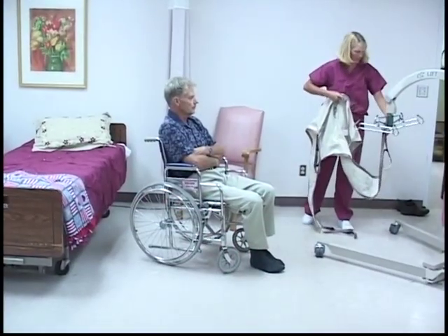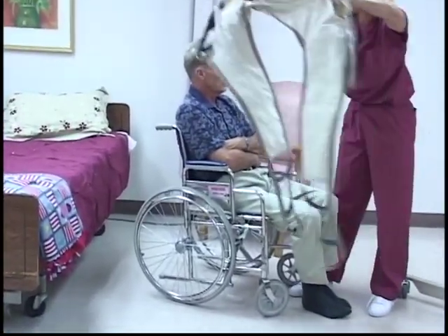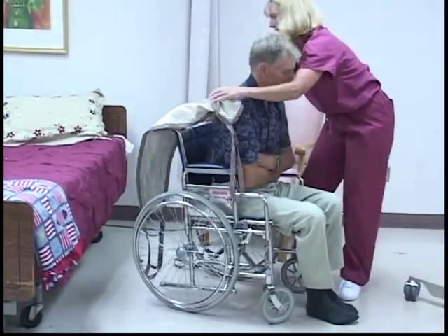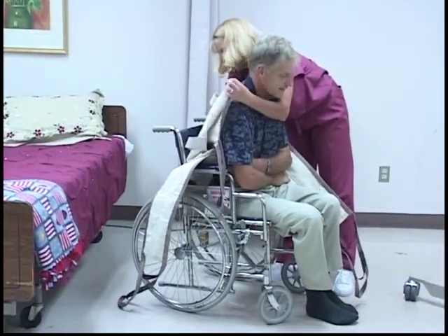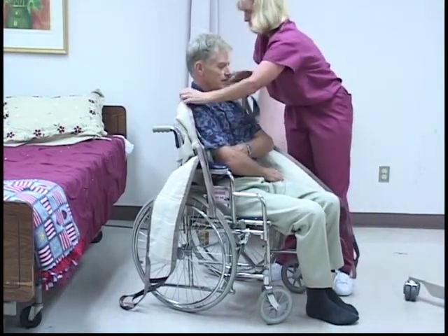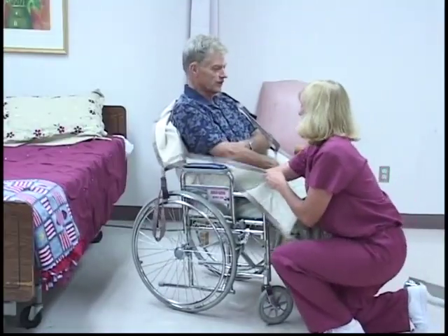When standing in front of the patient, lean them forward several inches to facilitate the positioning of the sling behind the patient. With the sling handles and Easy Way logo toward the chair back, place the sling behind the patient, keeping the center handle of the sling centered on the patient's spine. Make sure the opening of the sling touches the patient's tailbone.